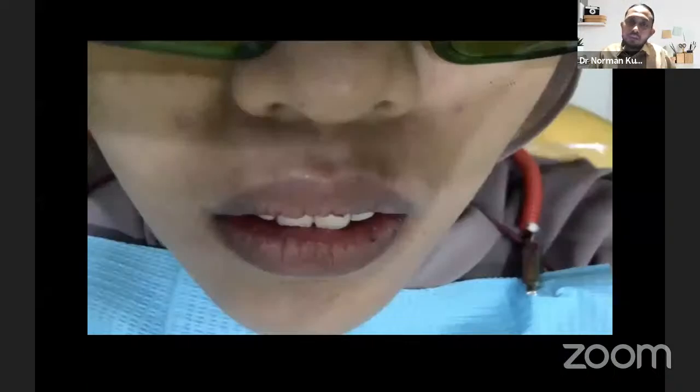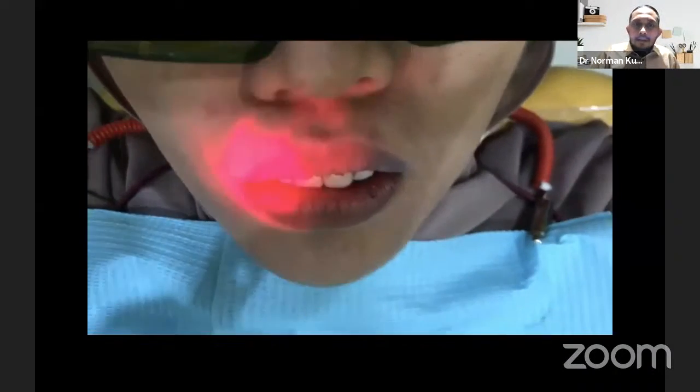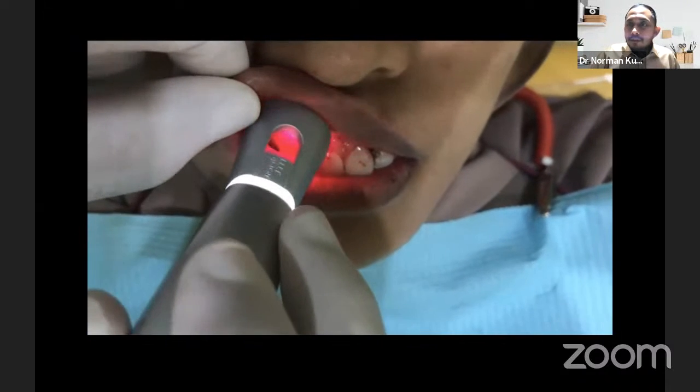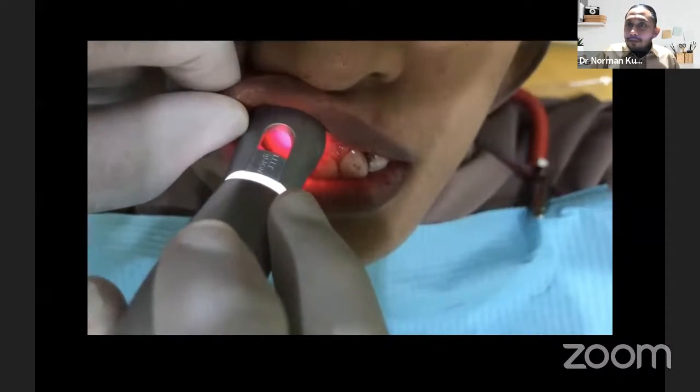After we finish the treatment, we do a therapeutic laser, as I mentioned before, a laser that can regenerate the healing process. So we do a surgical process with a laser, and we do a faster wound regeneration with the LLLT, or the low level laser therapy, with this device that I show you in this seminar. Like this one, after the operation I do the low level laser therapy.